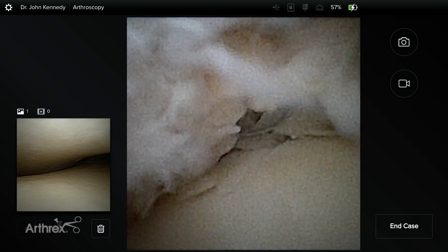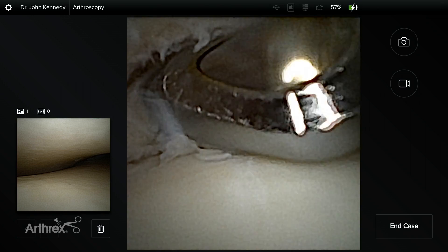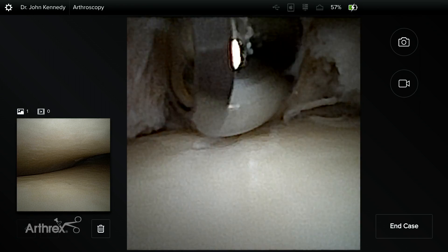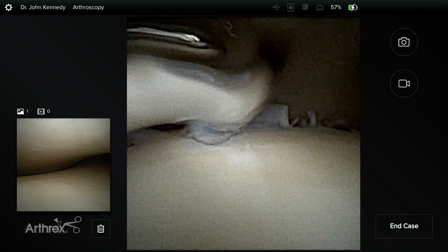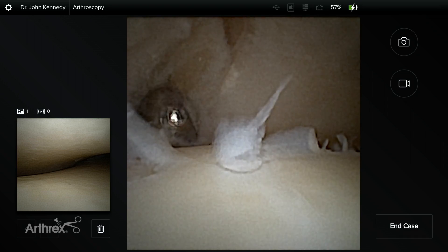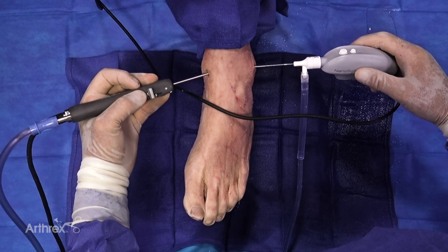We've now changed to the three millimeter resector or shaver, and you can see how that gets through the scar tissue a little bit quicker. We're uncovering some damage to the cartilage there — this is where we would typically expect to see an osteochondral lesion on the medial talar dome of the talus. As we shave more and more of this anteromedial impingement away, it's beginning to show more and more chondral damage. The medial malleolus is coming into relief now. When the athlete is running and goes into dorsiflexion, the soft tissue becomes impinged and over time it creates an osteophyte. With Nano you can get in and resect not just the soft tissue, but also take away some of that bone with three millimeter burrs.